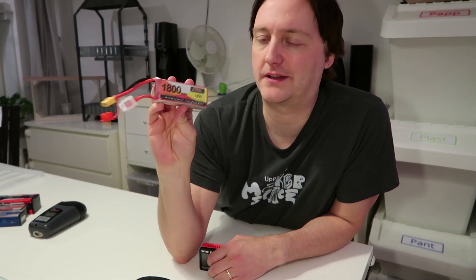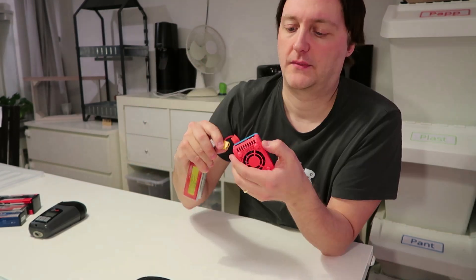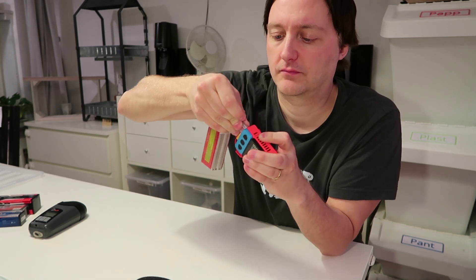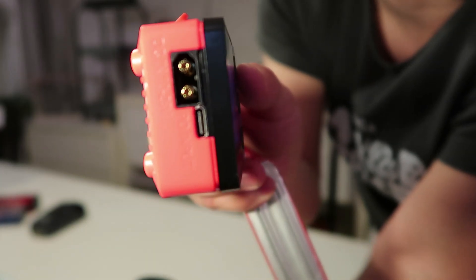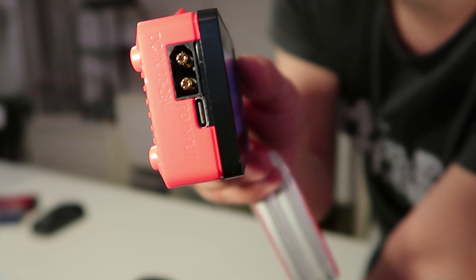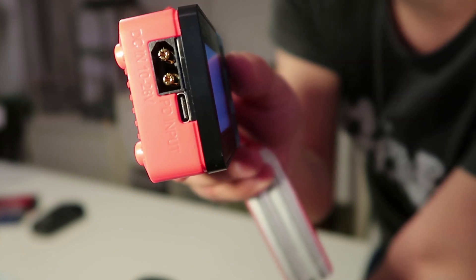To charge these LiPo batteries you'll need a LiPo charger. One I recommend is the SkyRC B6 Neo. You simply plug in the battery and then plug in a USB-C power adapter. If the adapter supports 20V, it will charge the battery really quickly.